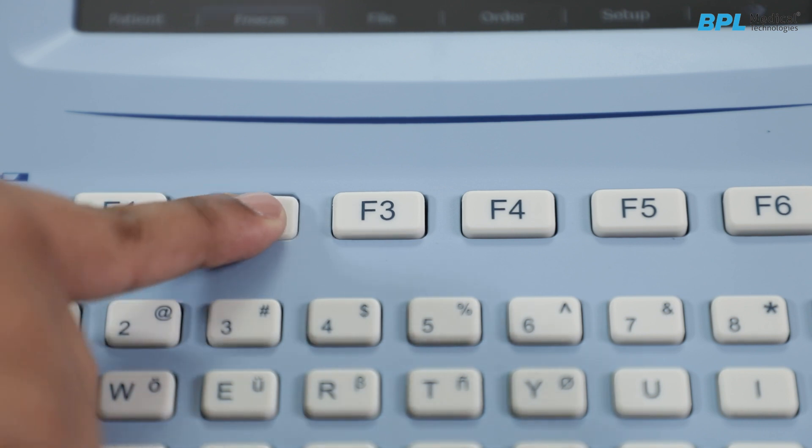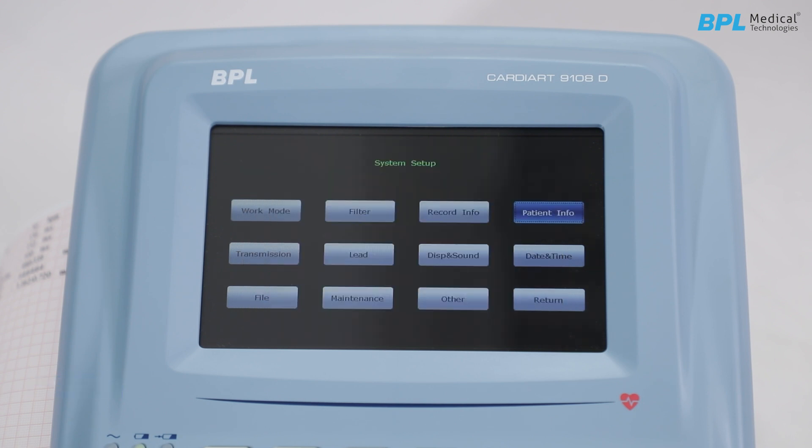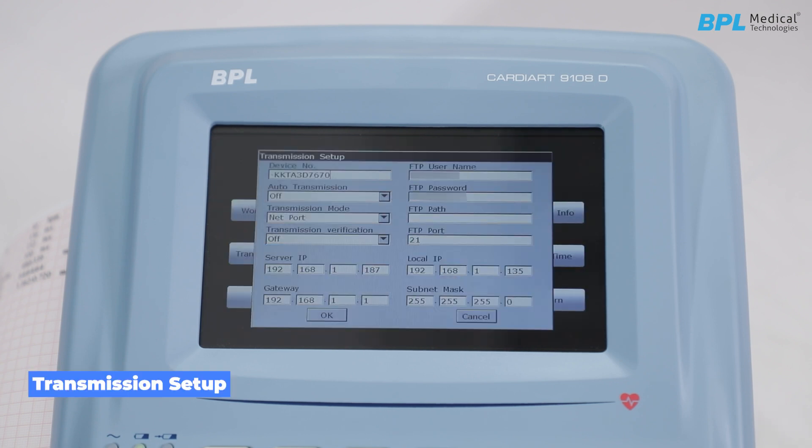Press F2 to switch to the next setup page, which is mainly used to customize the print report. In patient information setup, you can personalize the details required when registering patient details. For transmission setup, ECG data in SCP or DICOM format can be transmitted to a PC through SC1515 software. To transmit data, the server IP needs to be matched for easy data transmission.